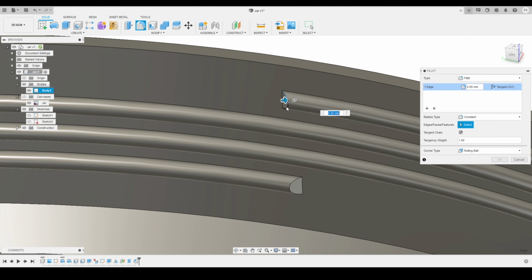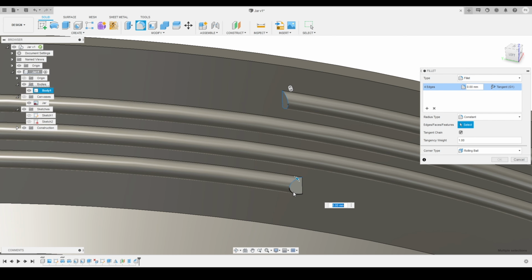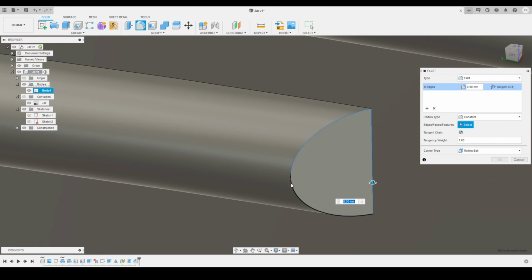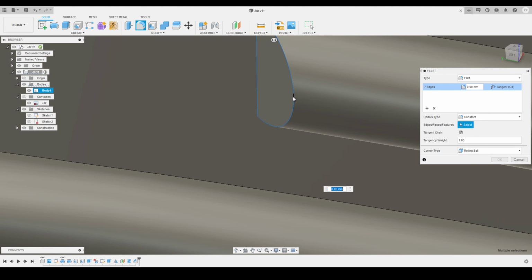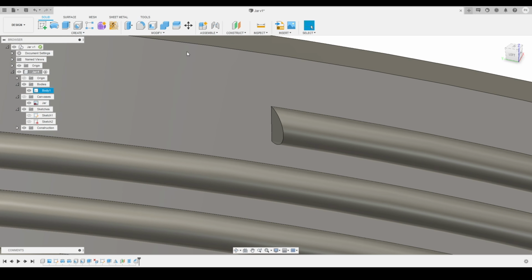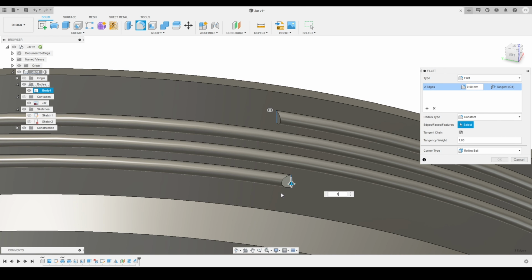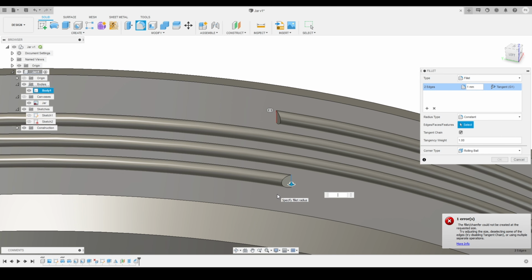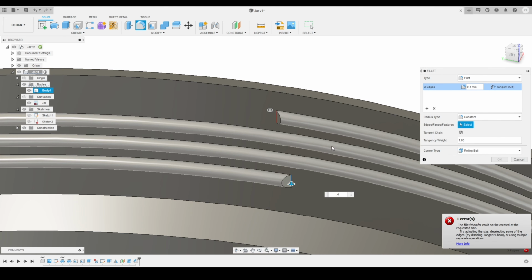And then we'll try to apply the fillet on these corners if it is possible, and if it is not working, we can just leave it like that. I'm just selecting all the small profiles and everything to make sure that we are not missing anything, and we'll try to apply the fillet, and it's not working. Here you can see it's giving me an error, so I will just leave it like that. We'll just apply a fillet on the bottom of these faces, and this is also not working, so just leave it like this, because in some cases there are very fine details where you will not be able to apply some features over there.